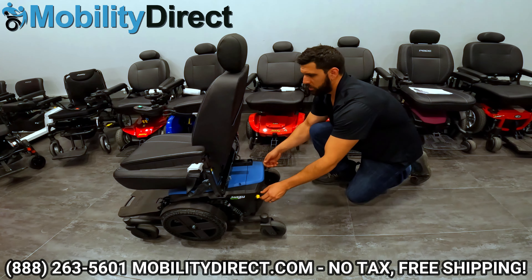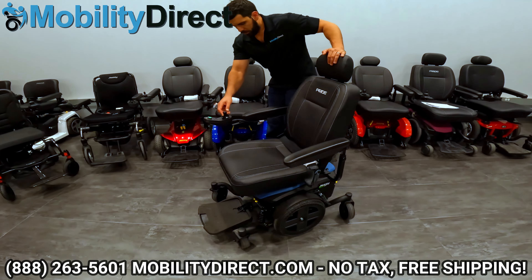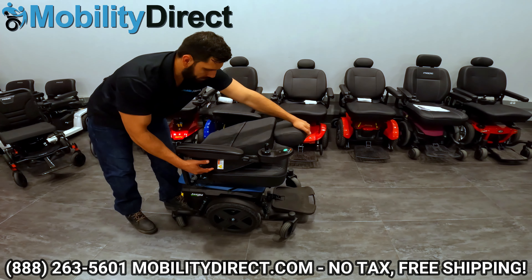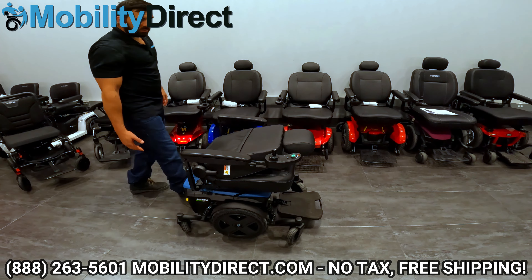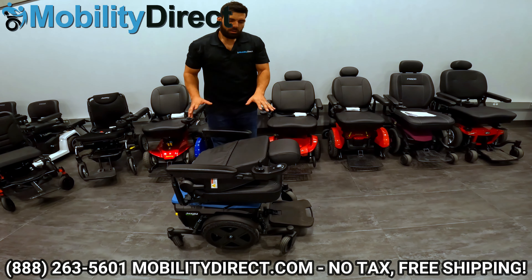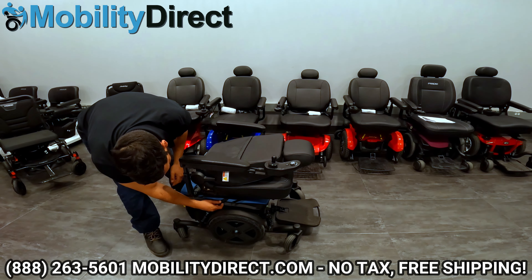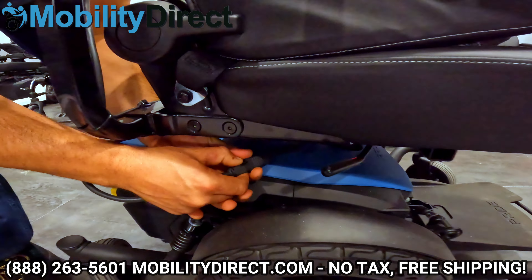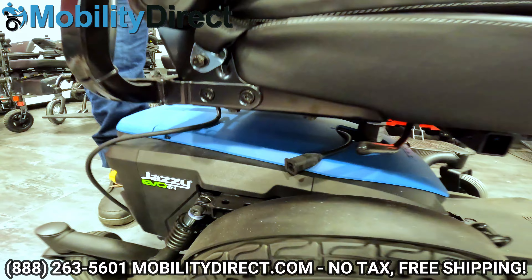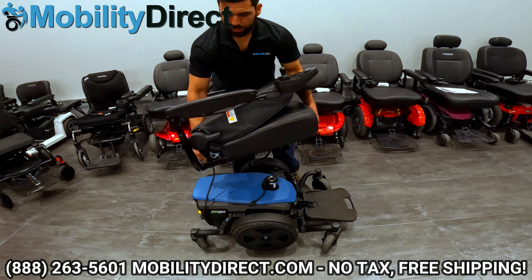Working our way back to the front, there's a nice little storage pouch on the back of the seat. There is a recline lever on the right side towards the rear of the seat, which you can use to slightly recline the seat or fold it all the way forward. When it's folded forward it makes it a lot easier to remove the seat. Make sure you power the chair off with the power button and always power it off when getting in and out of the chair for safety. Before removing the seat, disconnect the cable for the joystick — this little harness. Make sure it doesn't fall inside, then pick up from the back on the hitch receiver with one hand underneath the front and lift straight up — it's that easy.